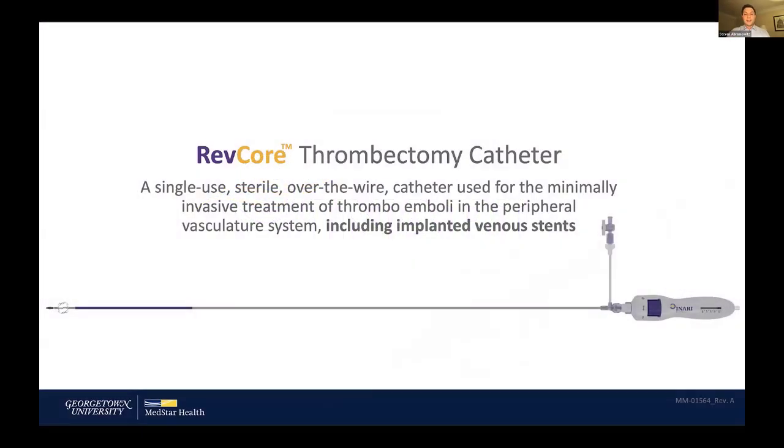The RevCore thrombectomy is part of the toolkit for dealing with stent occlusion, and it has to be used with a couple other parts of the toolkit. It is single-use and sterile. It can go through a 12-French sheath, but I generally prefer a 13-French or 16-French sheath when working with the device. I've used it from the internal jugular vein and from the popliteal vein. Its length supports usage from a variety of access sites, and it's designed to deal with the material it gathers within the stent.